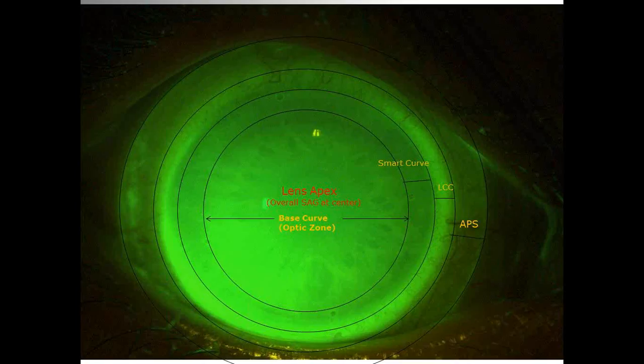And then that fairly broad landing area, which should provide good comfort, reduce the risk of compression and blanching and rebound redness and those sorts of things. So the overall picture is a lens where that final drill dot in the diagnostic set, which indicates the outer aspect of the limbal clearance curve, should be just a half millimeter or a little more than that beyond the limbus. Then we know we've got the right diameter.